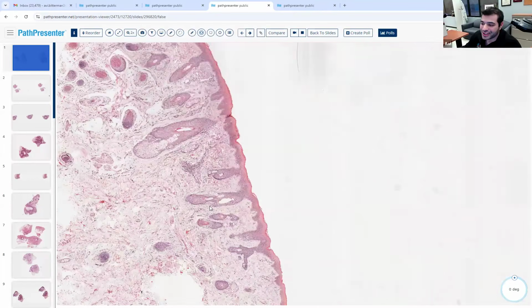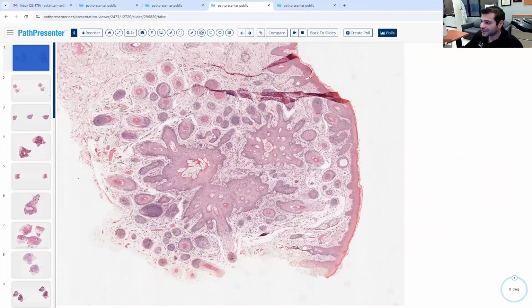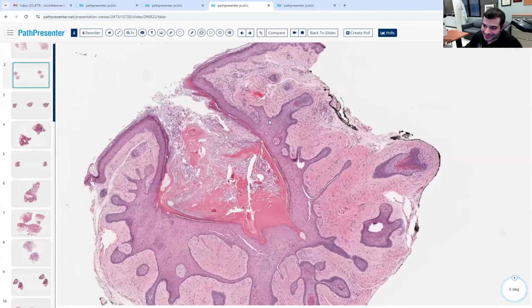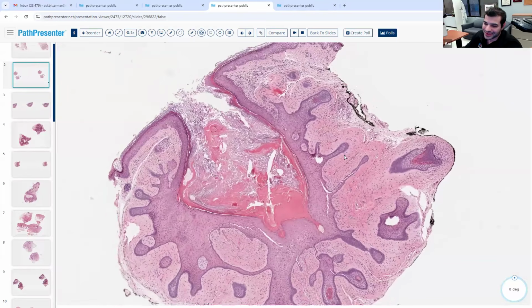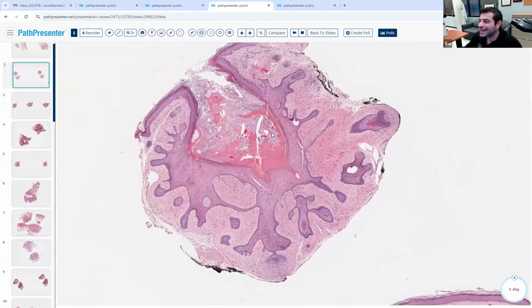And this is, by the way, usually how they test it. They usually don't give you that central cystic structure because, if I had to speculate, they think it's too easy. They think, I'm not going to give you the central cystic structure, I'm just going to give you a side cut. That's how I'm going to test it. So here, it's more obvious, right? You can confirm this is hair making, you see your trichohyalin granules, and then you can see your central cystic structure. But that's usually not how they test it. They usually test benign or malignant.